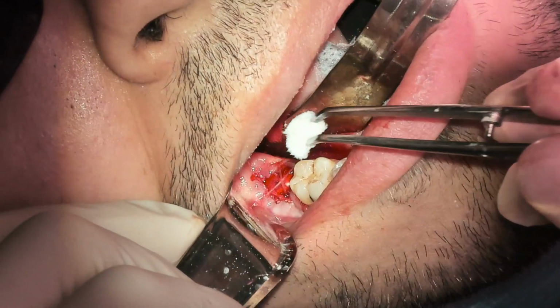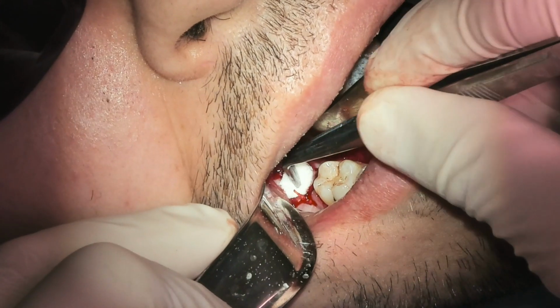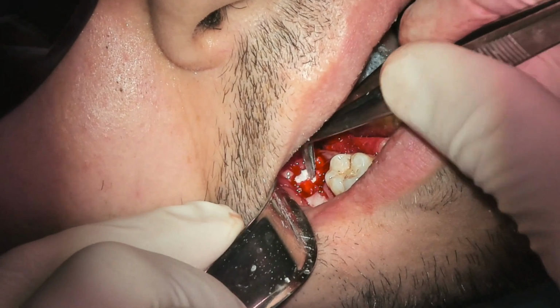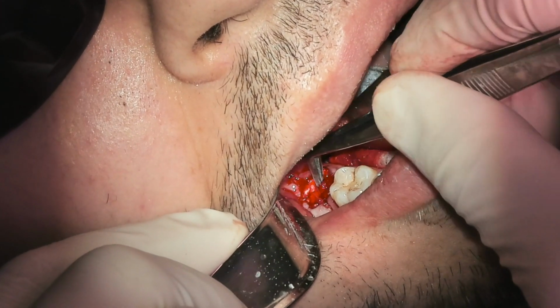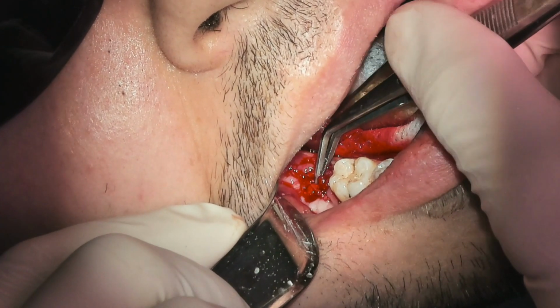And then I believe I asked for another section as well, because I wanted it to be a little bit more densely packed than that. Looks pretty clean here. And there it goes. There's another part of some gel foam. I personally like to pack it pretty densely. Depending on the practitioner, they're going to tell you otherwise.